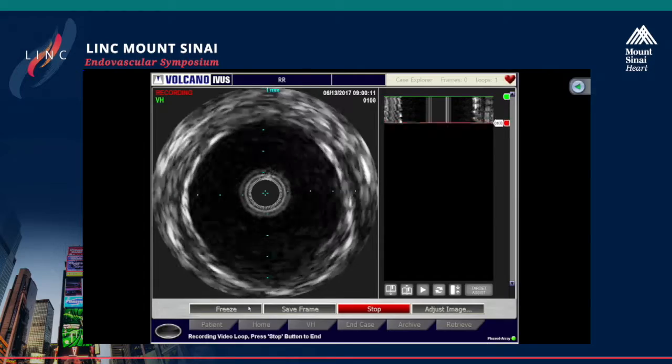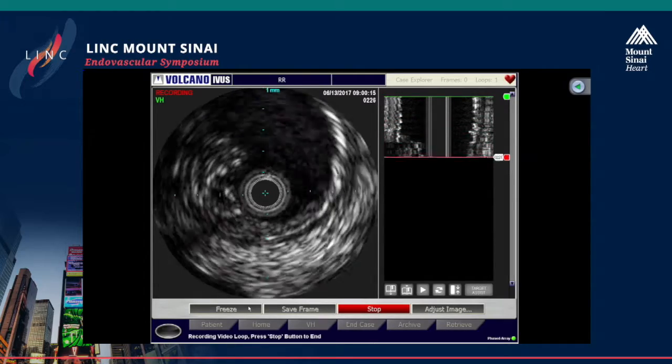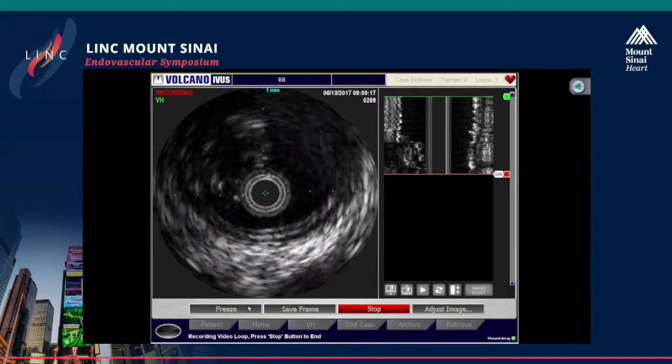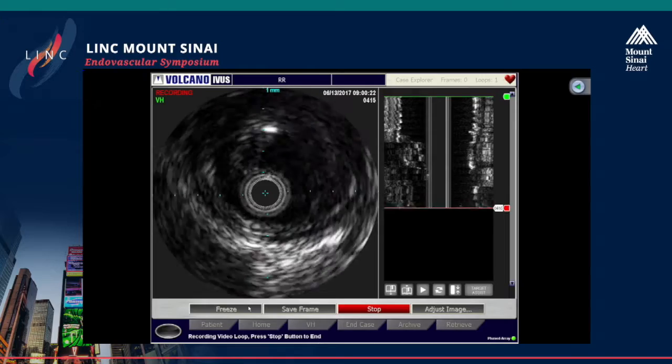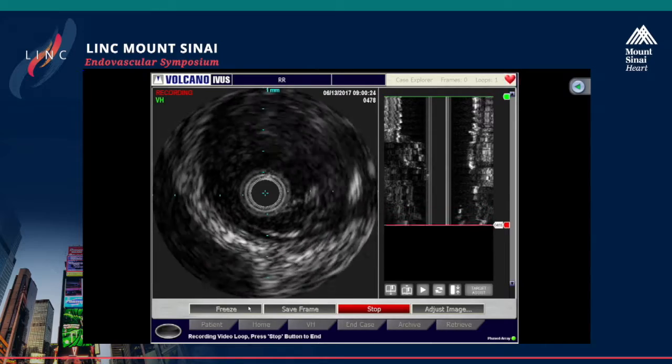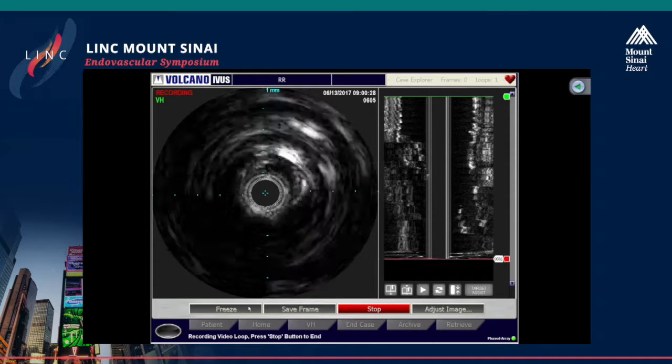So I don't have this experience. And I know people that are implanting Superas in AV fistulas. The nephrologists like to have the Supera over there. They feel it very well, and they can puncture it 3 times a week without any problem. So repuncturing, in my opinion, is not an issue.